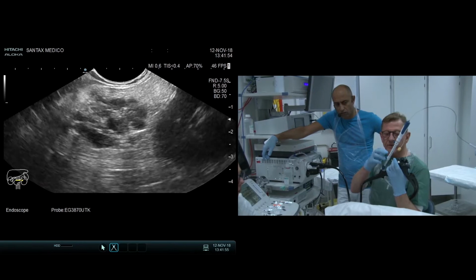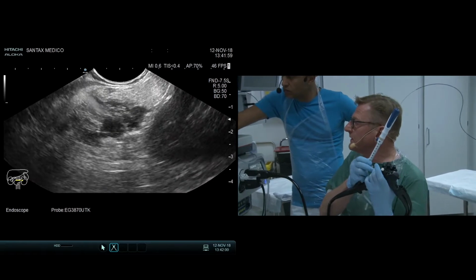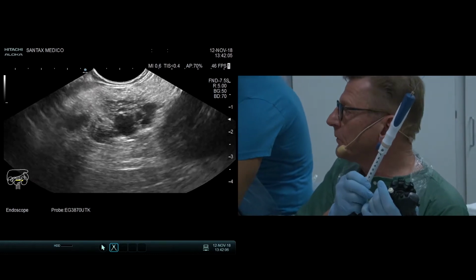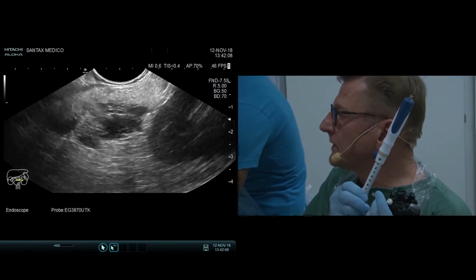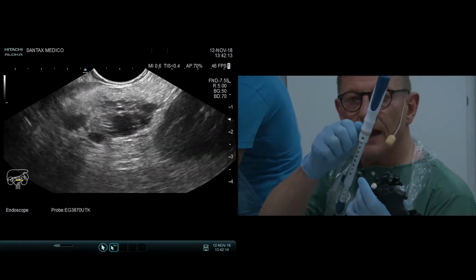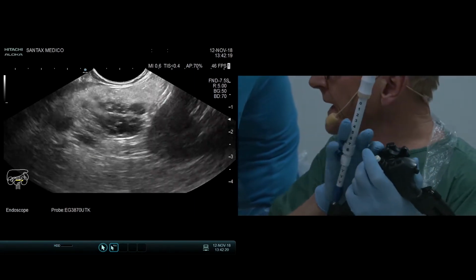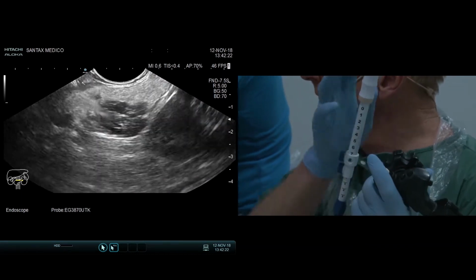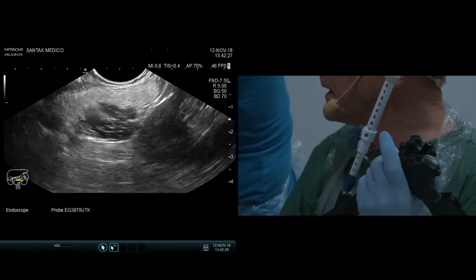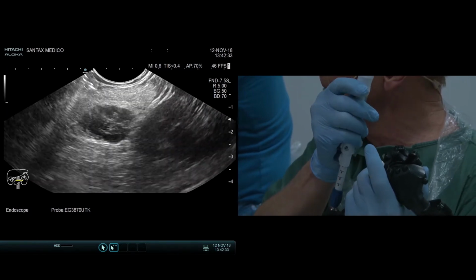The sheath length, I start by introducing the sheath. Here you can see on the left side of the image, maybe Adrian, you can show, I manipulate a little here, which is the sheath length. Here you see it. And then I lock it, not too far down. And next, release the piston. And then I have to get the direction of the needle. And it seems to be somewhere there. If I expose the needle tip, it comes here.